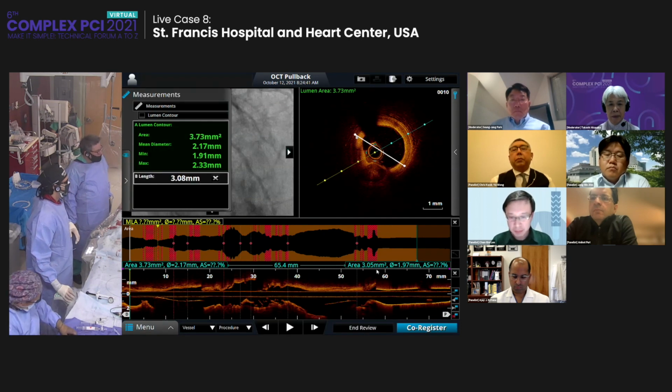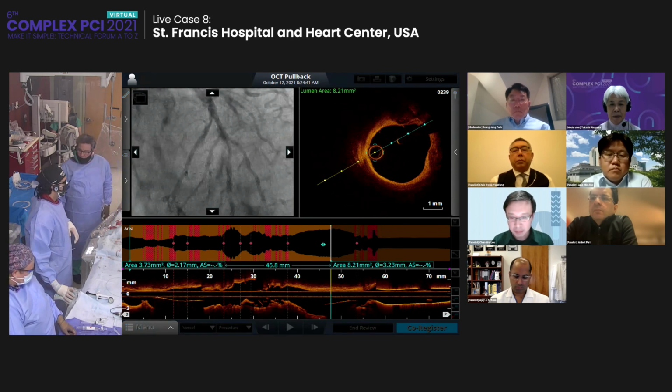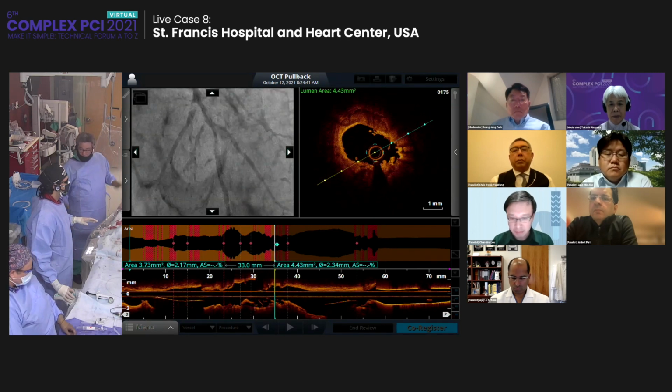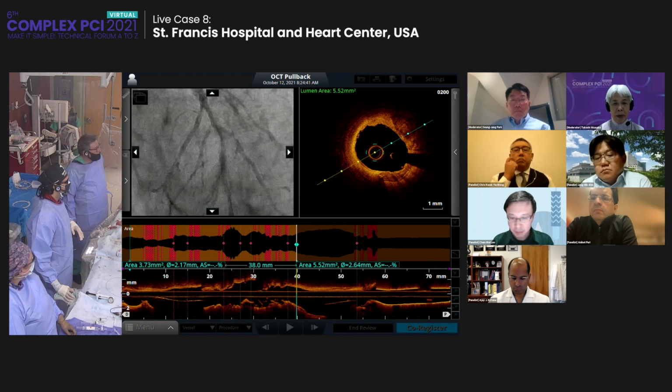Still the same size device. But I think we're going to be longer, yeah. So we may be at 33. Let's just wait. So here you can see all of this is kind of pulverized. So what we're going to do is come back. We're probably going to need a 38 actually. So if we land a 38, that'll last us here.